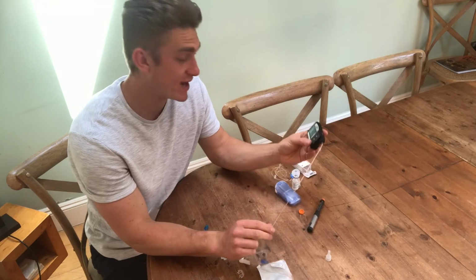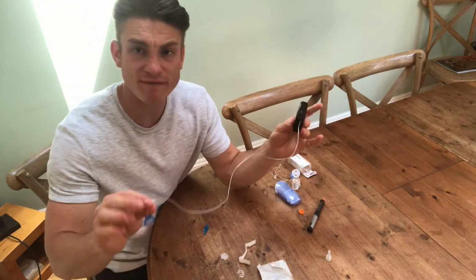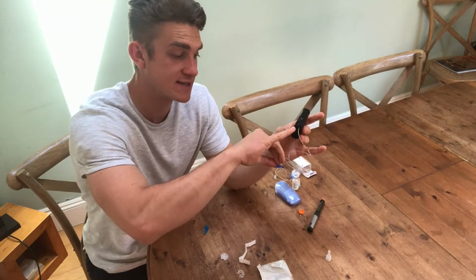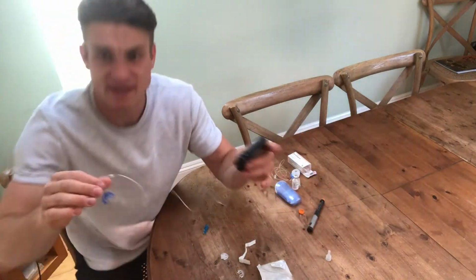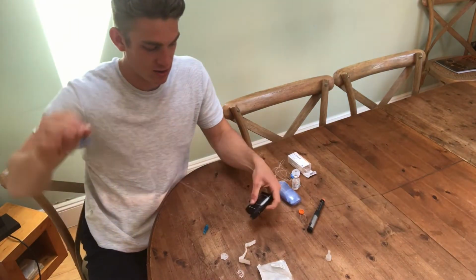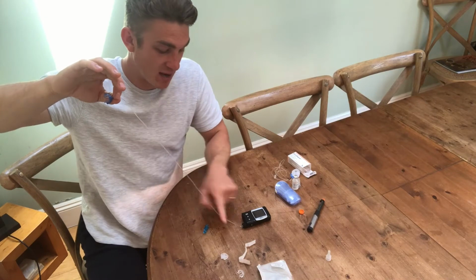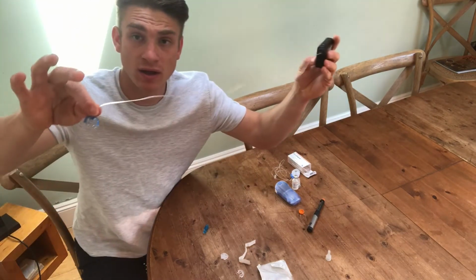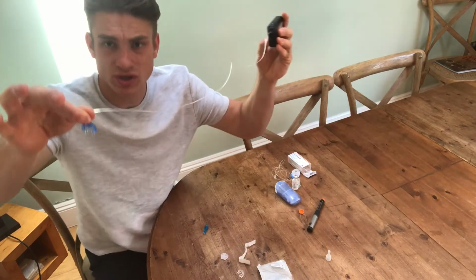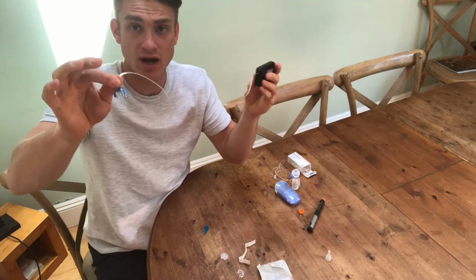Once the cartridge is ready, you press continue, and then you have to prime it so it can then start going through this tube to the needle, because if I put it into my body now, it's got all of this time to fill up before it actually goes into me, so you've got to make it ready. So I'm going to prime it, I'm going to watch the insulin come out the end. Okay, it's gone through the end, I know it's ready to go.